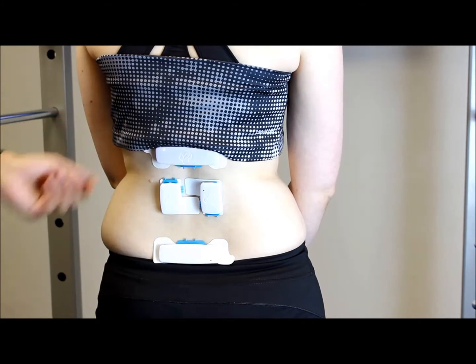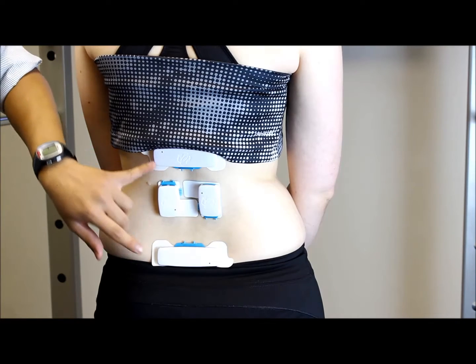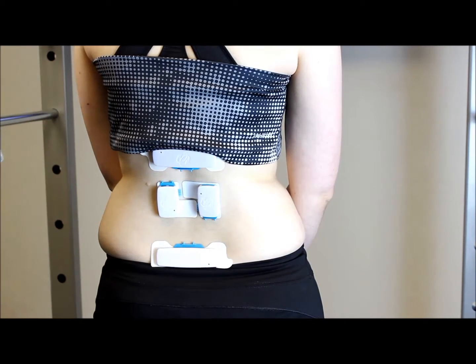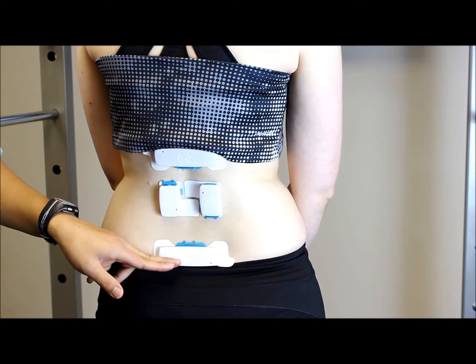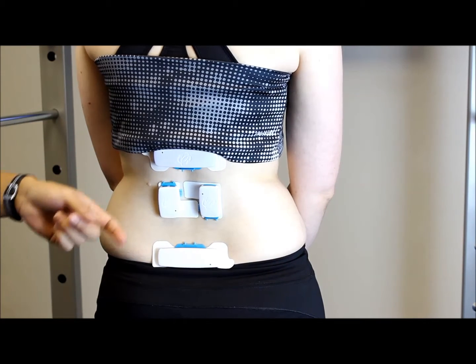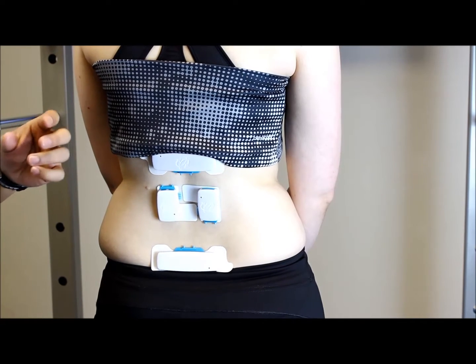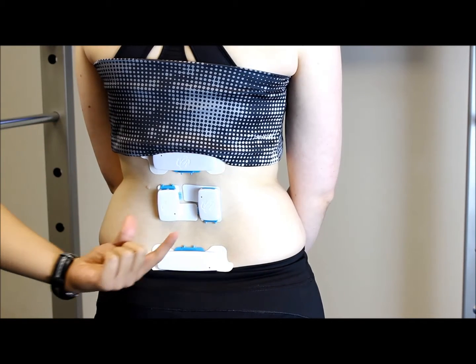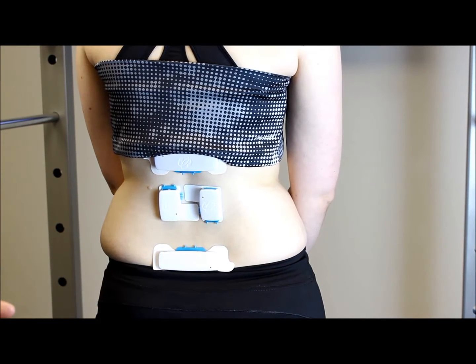As we can see on our model here, we've got four sensors. The top and bottom sensors look at how the patient moves — the bottom one represents what happens at the pelvis, whereas the sensor at the top senses what happens at the top of the lumbar spine. The two sensors in the middle are your EMG sensors.